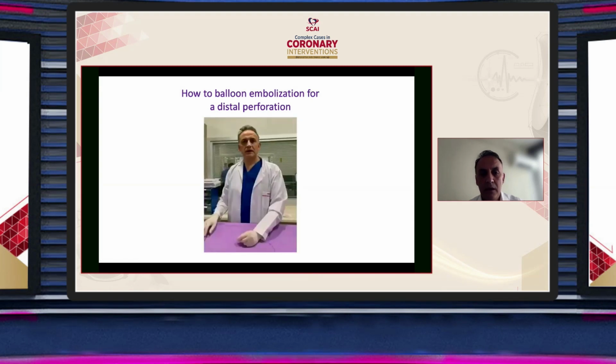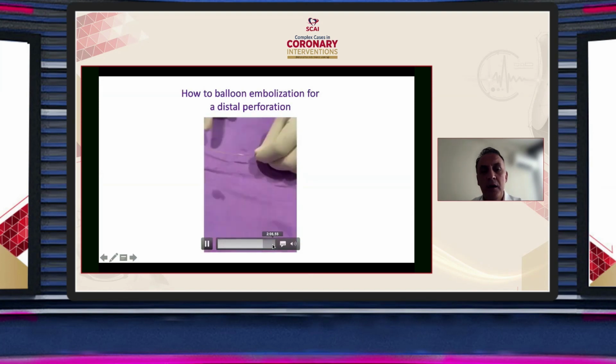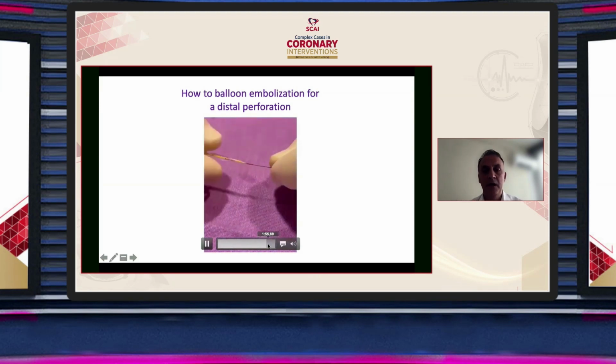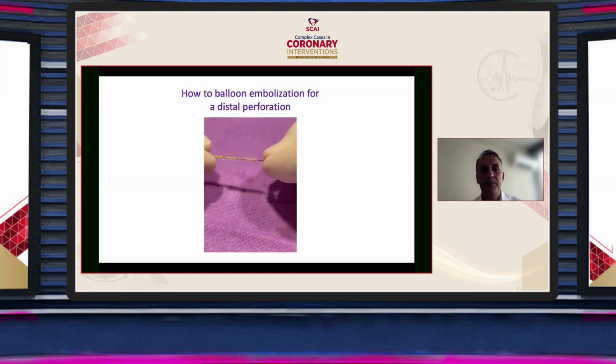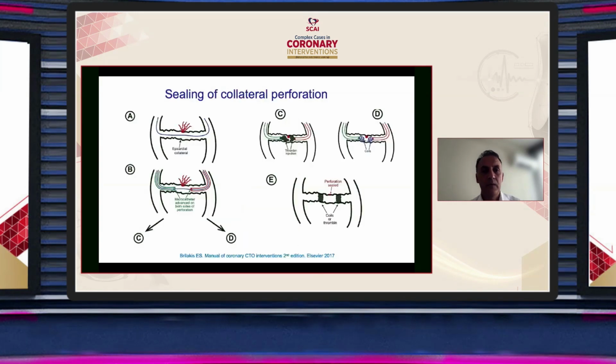These days for the distal part, it's really cheap. We also use, of course, coils for epicardial collaterals, but for distal perforation, this is very helpful. When we inflate the first balloon, the cut balloon stays at the distal. When we remove that wire, the balloon stays there.